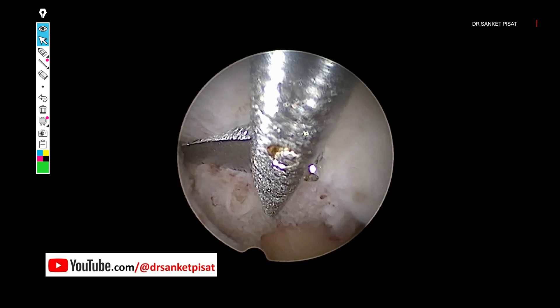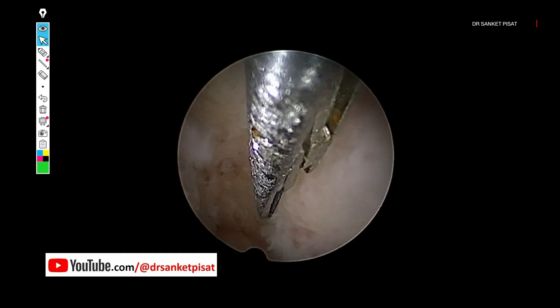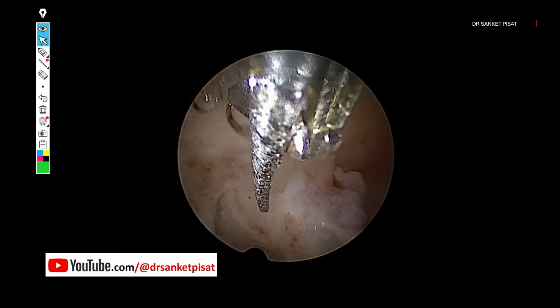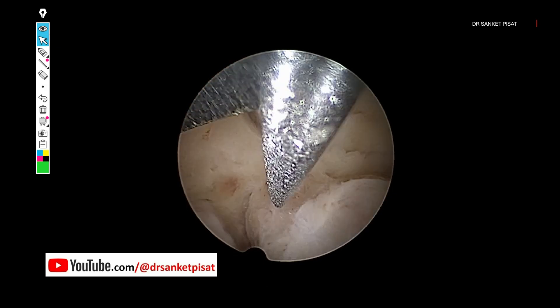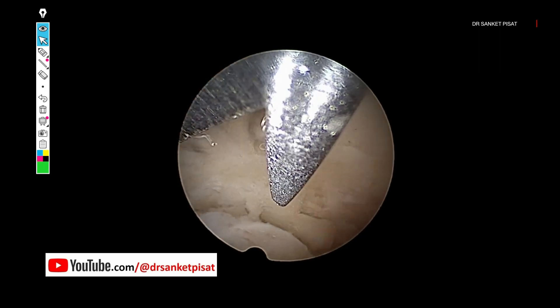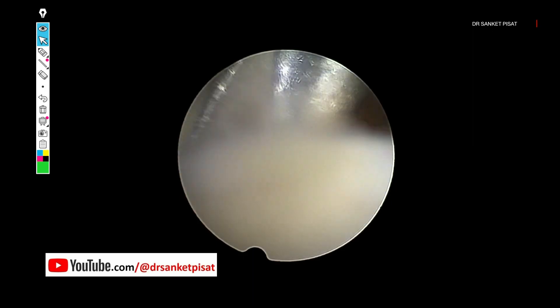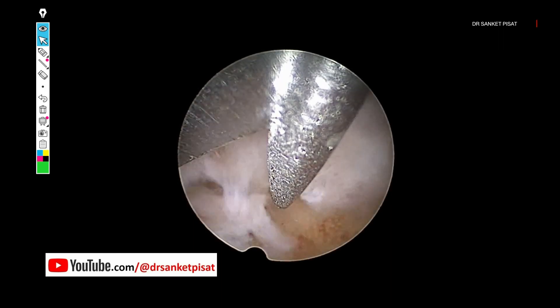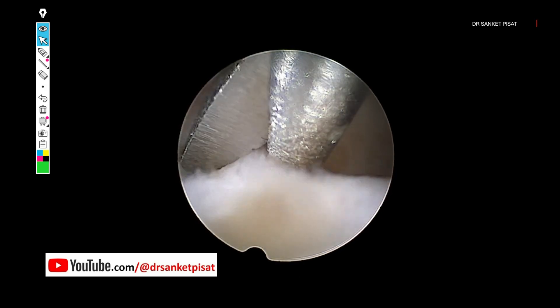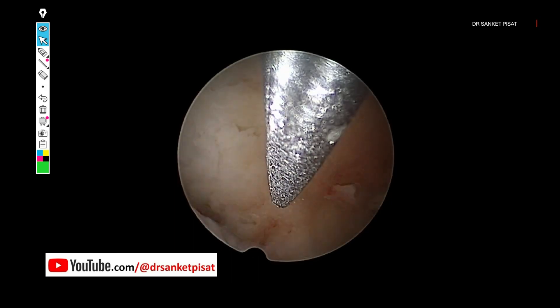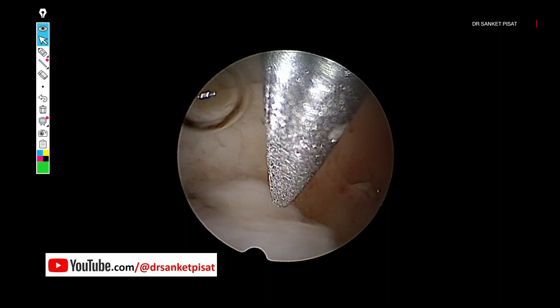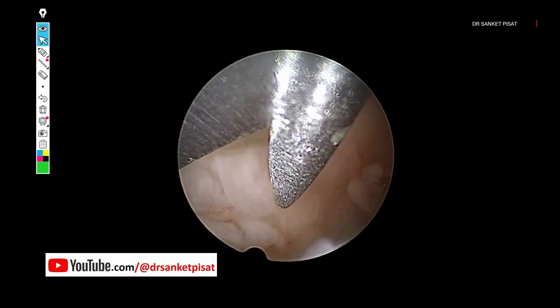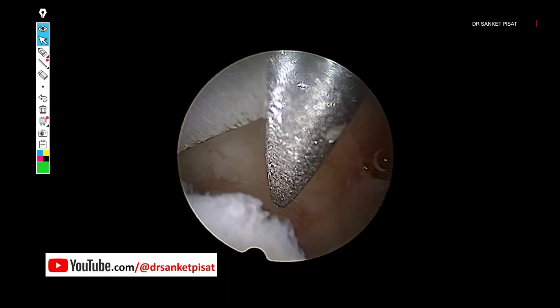The polyp seems quite large to come out through the internal os, where it will find maximum resistance. So I am cutting it into two or three smaller pieces, which should be easy to grasp and remove through the internal os using the hysteroscopic grasper. The polyp has been divided into parts and now we are cutting off the base so it can get detached. The difficulty always remains in polyps attached to the fundus, as it is a little difficult to reach the base.